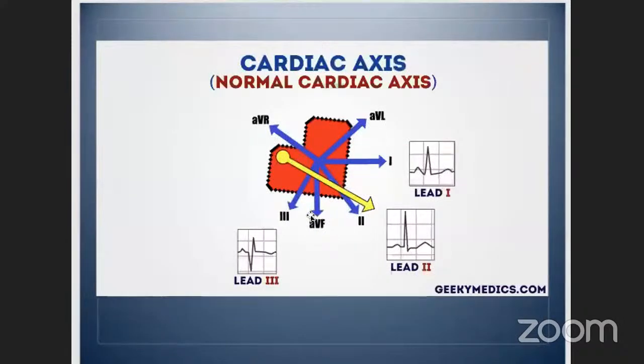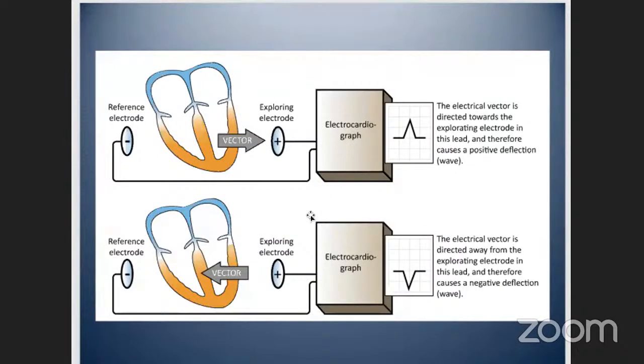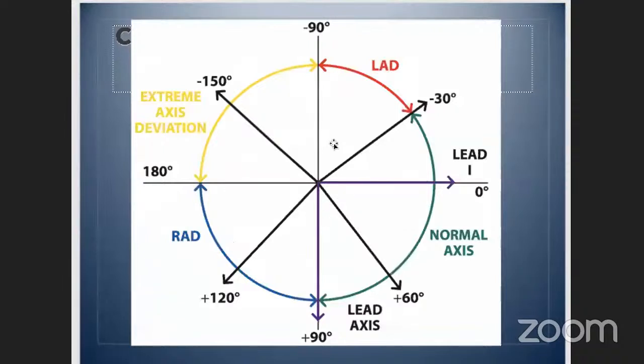So cardiac axis, there are a lot of different ways to consider it, but we know that ECGs are leads or electrodes put on the chest, and they just pick up the sum vector of the electrical activity that is moving towards that electrode. Our heart is sitting here within our chest, and the bulk of a normal heart is always aiming for an axis of roughly 60 degrees. This is what we use in looking at our limb leads to determine the axis.